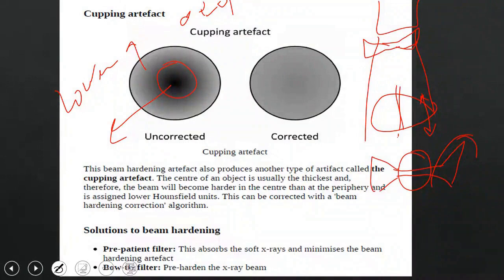So in this case, what do you do? You make the beam going to the periphery the same as the beam going to the center, which is the same beam going to the other side of the periphery. According to what? You don't keep it the same. You provide an equivalent or suitable X-ray for the thickness that the periphery will encounter. So this area does not need a large X-ray, so I will use a low X-ray. But this area needs a high intensity X-ray, so I will increase the X-ray here. As for this area, it needs a low one.